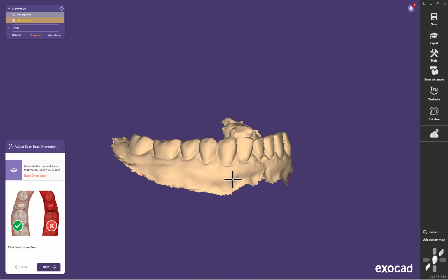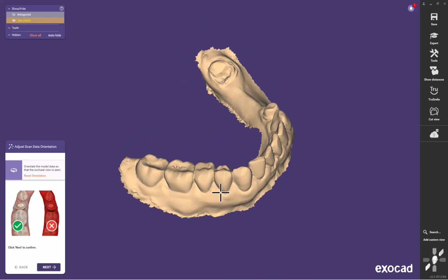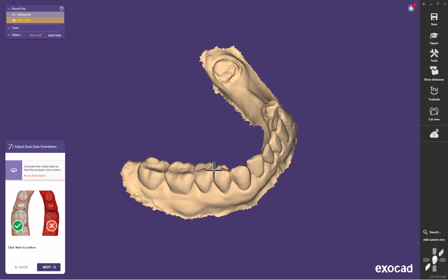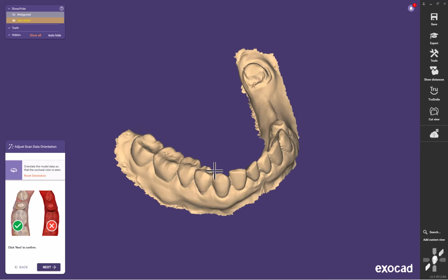So we start to go through our TMJ exam, and we're looking at centric relation. And in centric relation, she felt like she hit first on this right premolar. But when we marked it, we found the first point of contact to be back here on the second molar. Because we're manipulating her into CR, with paper in between the teeth, we just bring her into light contact and tap at the moment of CR.